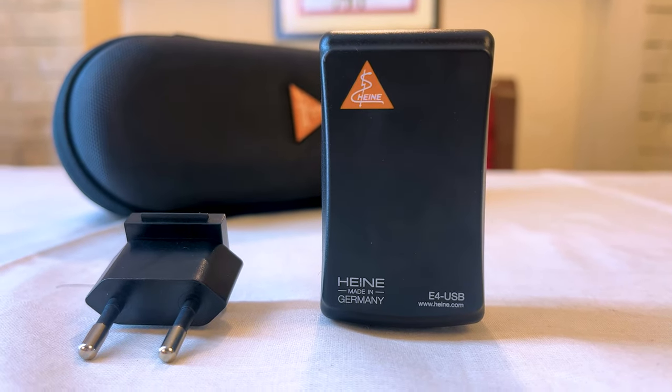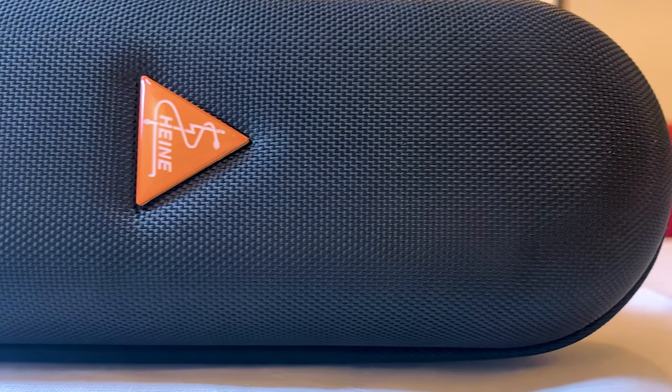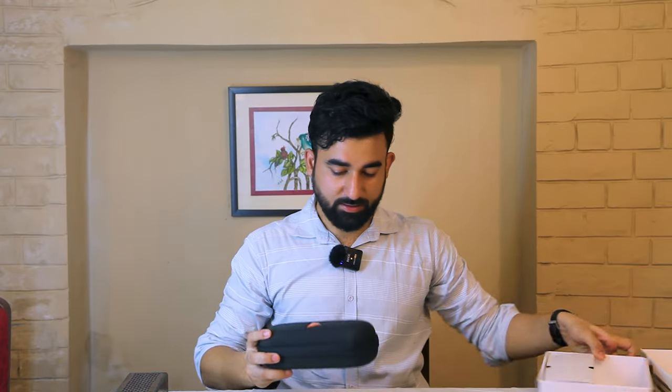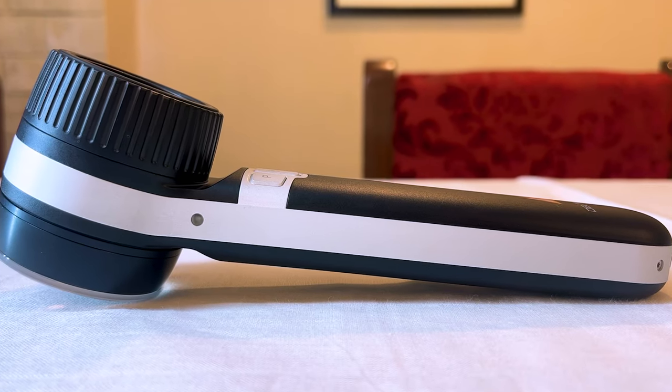Now we are talking about the zipper pouch. Look at the branding — it has Heine branding on the side. It looks very attractive and premium quality.